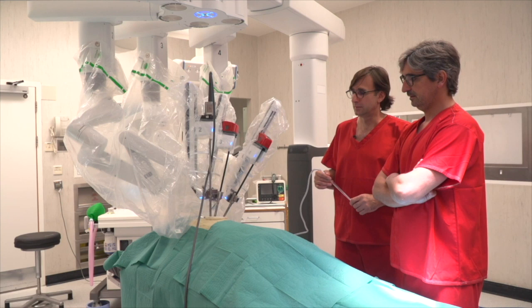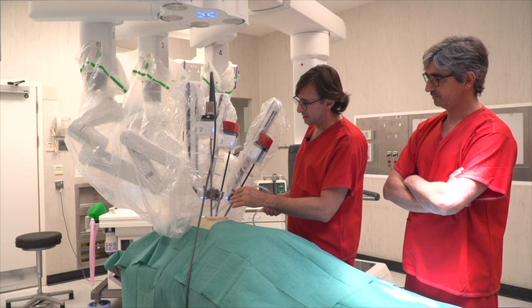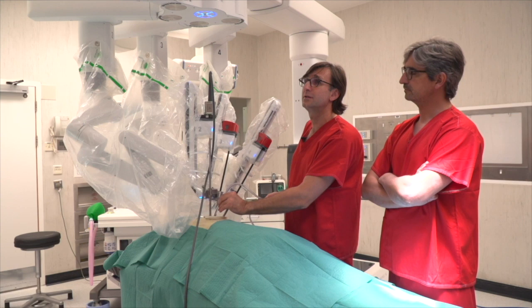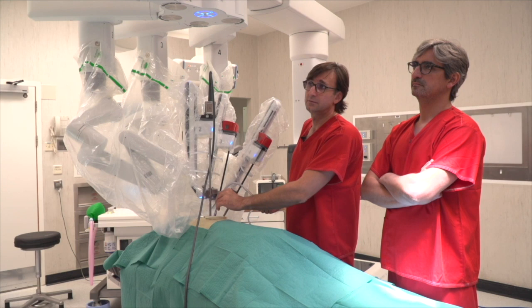The suction must be kept as much as possible near the camera trocar. It is the best position to have. And under the surgeon's instruments, you see, under. Always under, not between, because you will hurt the dissection field.